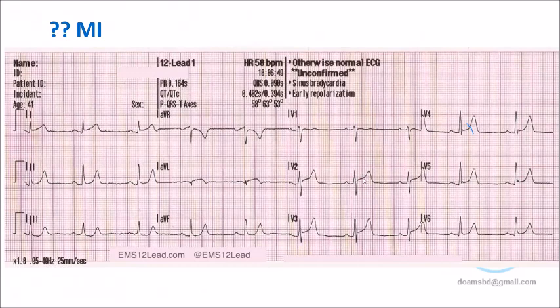So this is the ST segment, and the T wave is clearly visible separately. It is not myocardial infarction, though it is ST elevation, no doubt. So by term, we can say this is J point elevation.